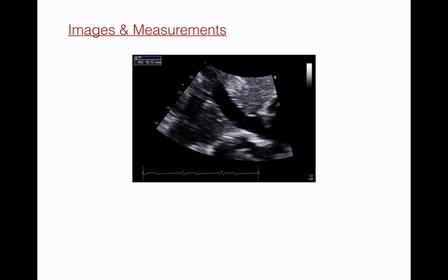Imaging the IVC can be difficult. Always aim to position the probe just to the right of midline. If imaging is a challenge, apply some more pressure as needed. Ask the patient to bend their knees and to inspire. Furthermore, color Doppler may help to identify the IVC.